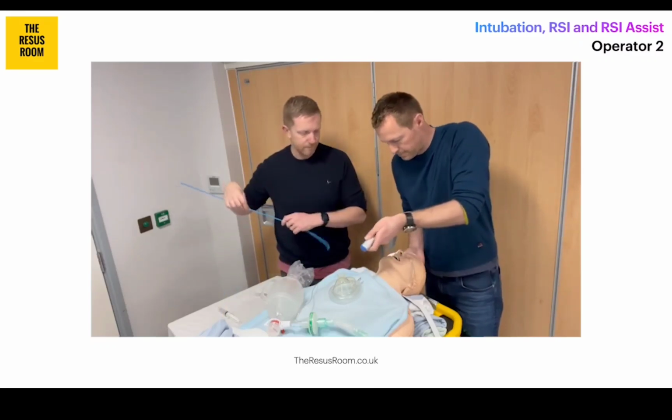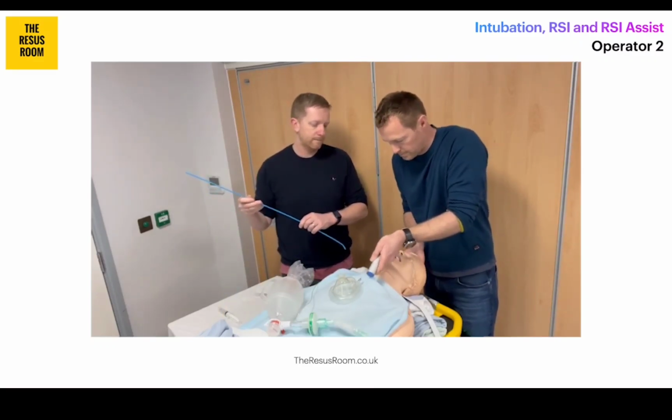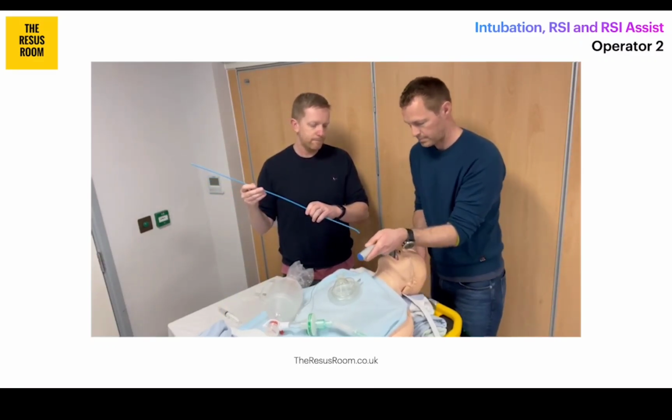Okay, look at Simon's eye line. He is watching my technique like a hawk. Now, that is not because I'm a rubbish intubator. Well, I mean, maybe it is, but nevertheless, given his position relative to the patient, he is really well placed to comment on several aspects of the intubation, such as how deep the blade has gone in.